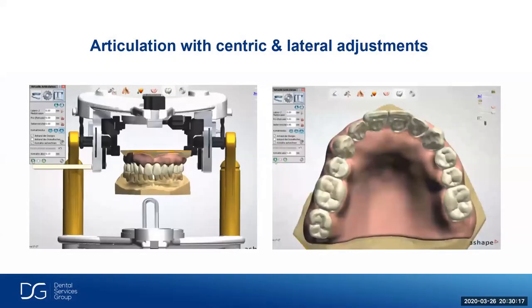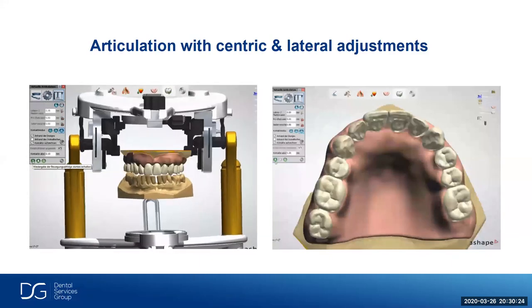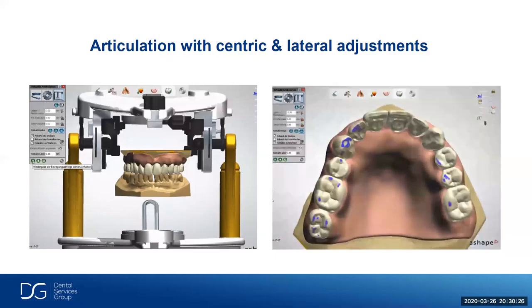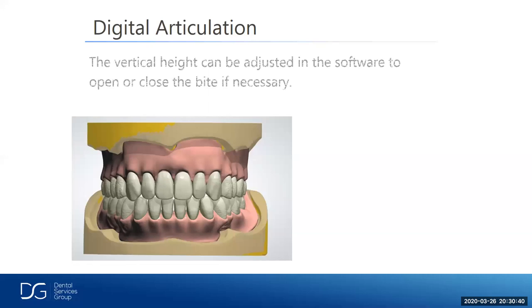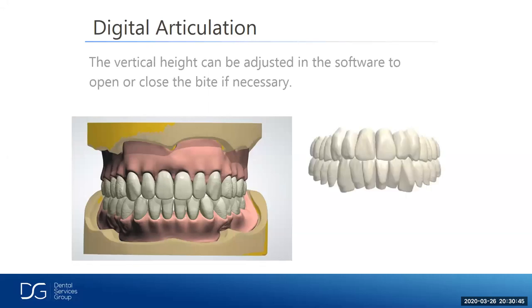And this is articulation with centric and lateral adjustments. You see, this is an upper denture going against natural dentition. So this is done automatically for us in the software. And on digital denture setups, the impressions are digitally articulated to the bite registration using special software. And denture teeth are placed following the arch shape and the bite registration. And the vertical height can be adjusted in the software to open or close the bite if necessary.